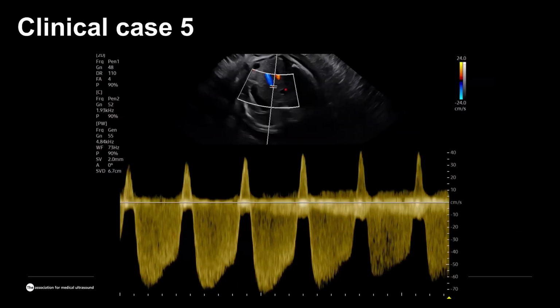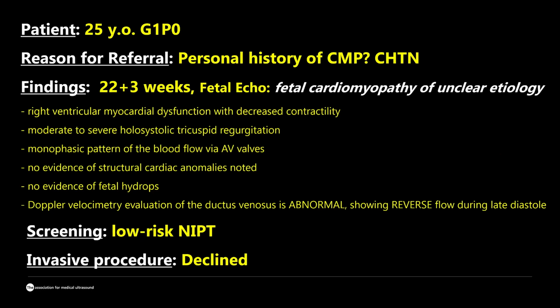We also saw a significant abnormality of the ductus venosus blood flow, the reversal flow during atrial contraction, and all this was put together as these findings. And as you can see here, this is the first pregnancy for this patient. She had some sort of cardiomyopathy that manifests at a pretty early age with chronic hypertension. And indeed, that assessment, and in particular the assessment of the blood flow across the valves, helped us to suspect fetal cardiomyopathy. After birth, that was confirmed not just in the baby, but in the mother as well. So they're carrying the same gene.